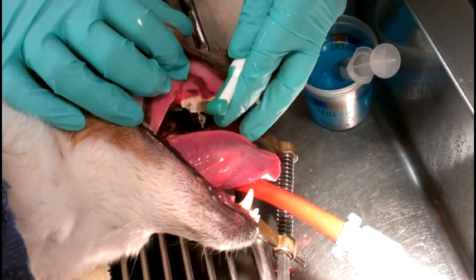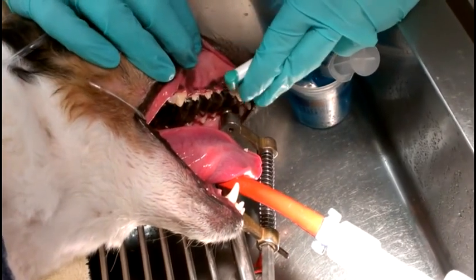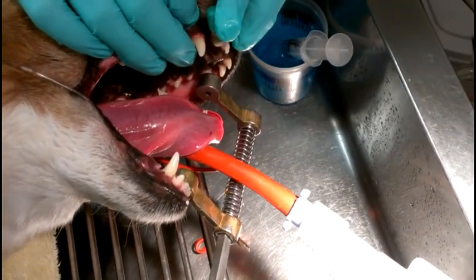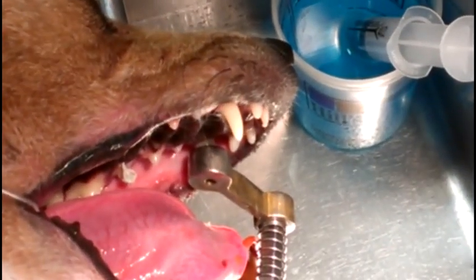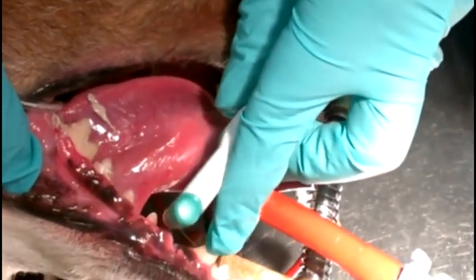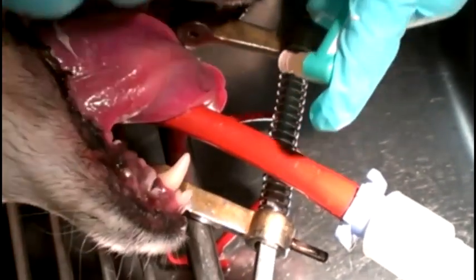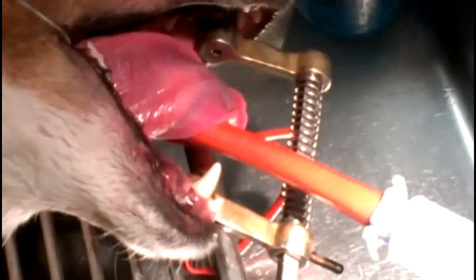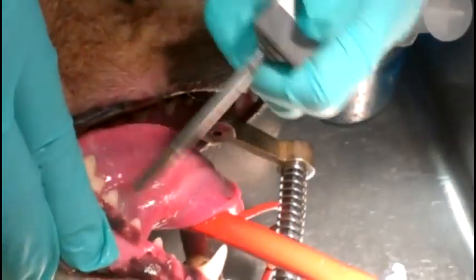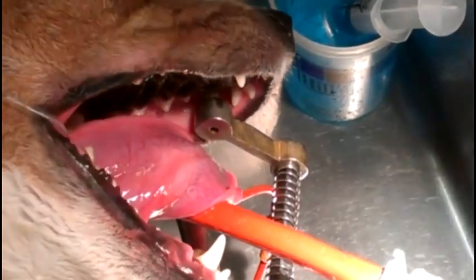What we do is polish all the surfaces of the teeth. That gets rid of any pits that are left in the enamel from the cleaning. And that's going to keep plaque and tartar from sticking. Also makes her mouth smell minty fresh, which the owners always like. Rinse that off with some air and water. All right. And that side of her mouth is all done.